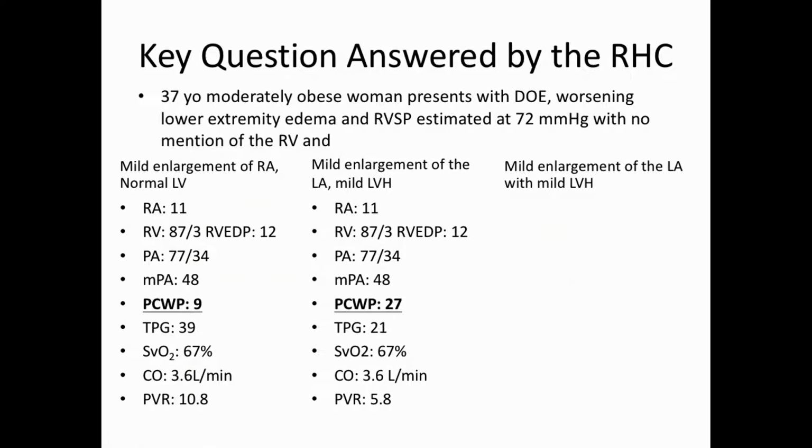The other important aspect here is the diastolic pressure gradient, which is now 7. You can see the pulmonary artery diastolic pressure here of 34 relative to the wedge pressure. And this would suggest then that this is all being driven by heart failure with preserved ejection fraction and probably represents secondary remodeling of the pulmonary arterial circuit.